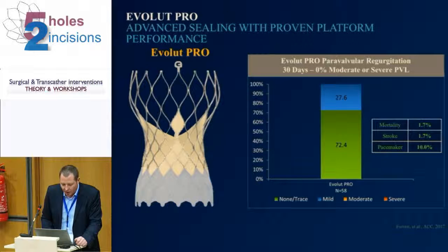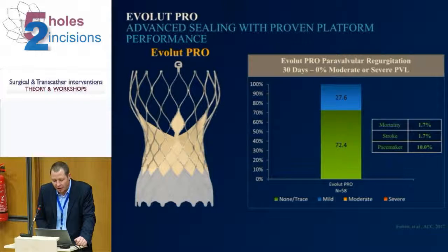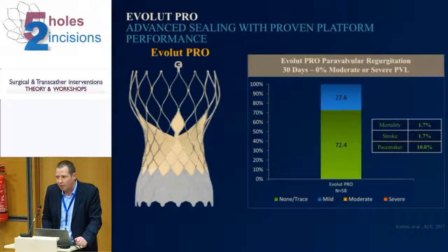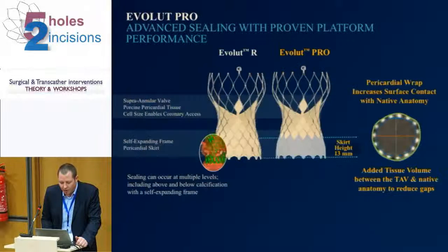So there's not much data around here. It's only 60 patients that have been published, and based on this cohort, of course, it looks like a very good, effective method. But again, we have to wait until the more realistic real-world data become available. I have also used it for a couple of weeks, and my personal impression is that yes, it does help a little bit, but there's one downside with it, because now it's not 18 French OD, but now it's 20 French OD. And whenever a company is willing to invest some French sizes to get more performance of the valve, I think this is something that we all should welcome, because it really doesn't matter whether you have 18 or 20 French. It's more about perfect valve function in the end.